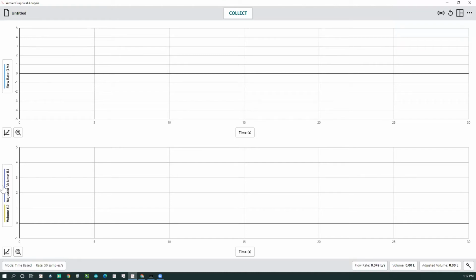John, I have a question for you. Sure. Can you reuse those bacterial filters or share them? You cannot share these bacterial filters. You quote unquote can reuse them, meaning one student can reuse them. The bacterial filters are designed to protect the spirometer from the subject, and the subject from the spirometer, as you're blowing in and out of it. So you could reuse this as long as only one student used it.